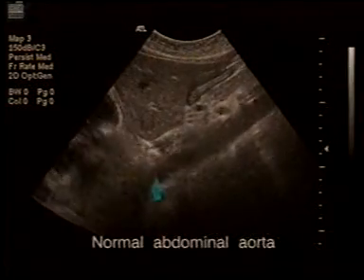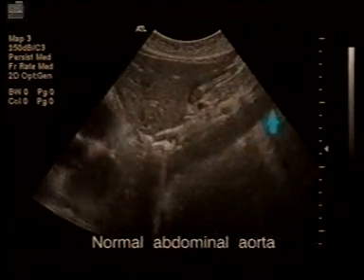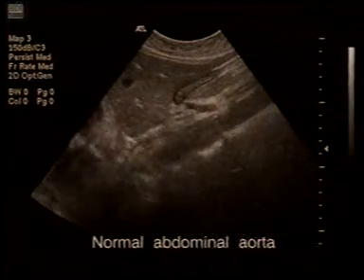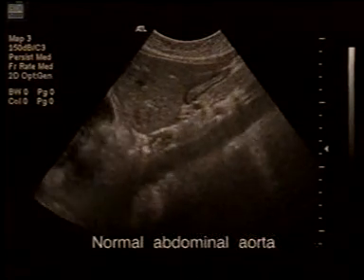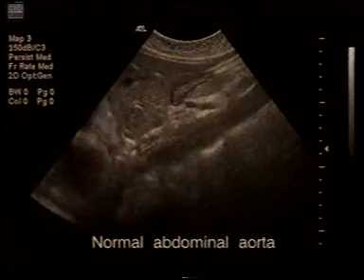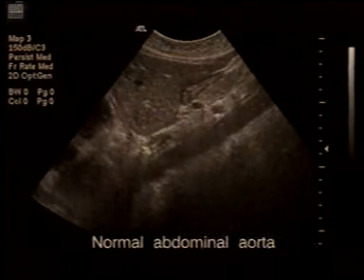This is a left parasagittal scan. You can see the aorta quite nicely here in its longitudinal extent. And this is the upper aorta. Most aneurysms, 85% of them, are infrarenal. We can see a couple of branches off the aorta here.